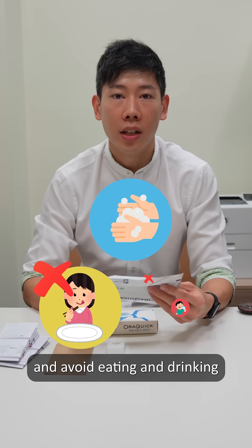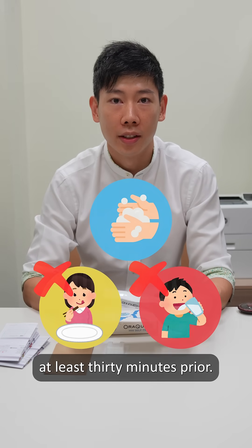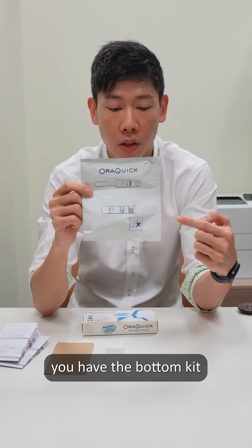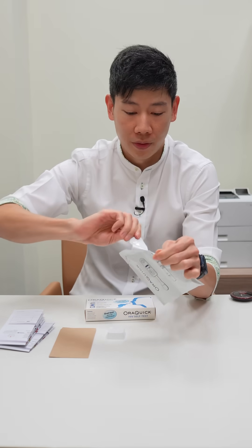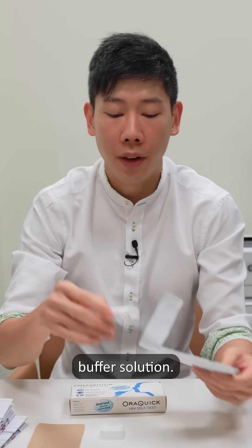Before you do the test, make sure you wash your hands and avoid eating and drinking at least 30 minutes prior. The first step to doing the test is making sure you have the bottom kit and opening the bottom pouch, removing the buffer solution.